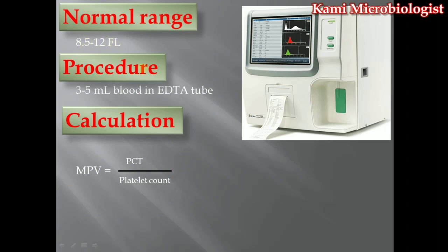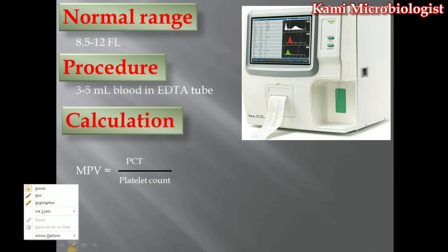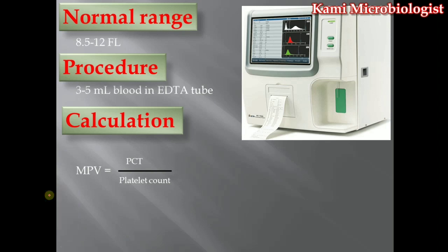Regarding the procedure: we need 3 to 5 ml of blood collected in an EDTA tube, and then we run it using a hematology analyzer machine. As you can see, we remove the cap and dip the needle into the blood in the EDTA tube, then press the button. The machine takes the blood and after about five minutes it gives not only the MPV value but also all the other CBC parameters as well.